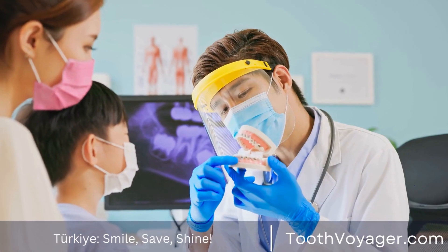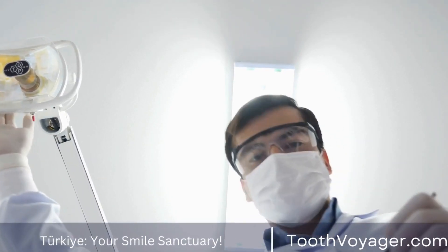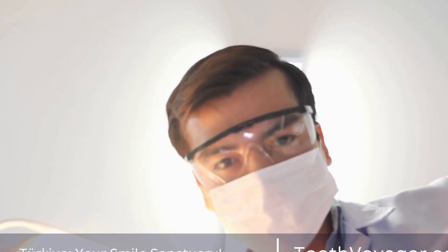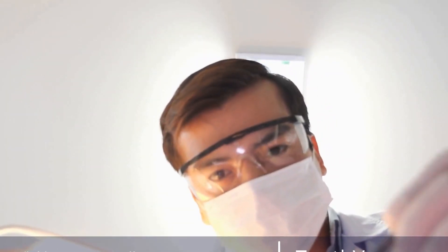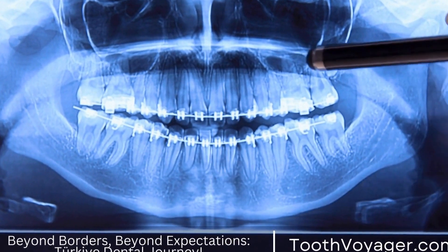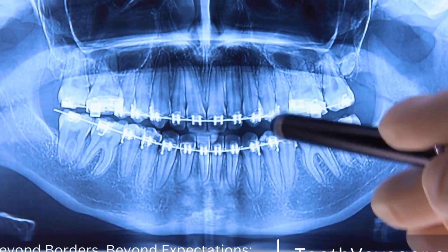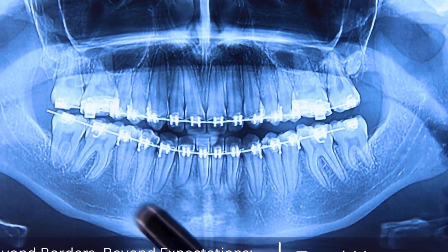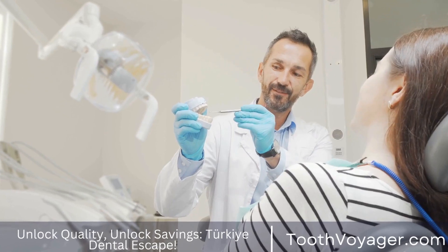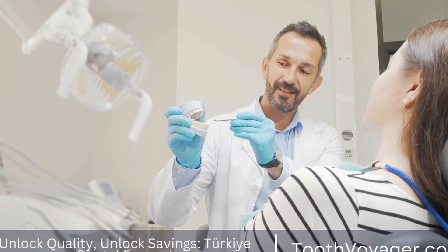Treatment Planning Software. Digital dentistry has also improved treatment planning for complex procedures such as dental implants and orthodontics. Specialized software allows dentists to analyze the patient's jawbone structure, tooth alignment, and bite mechanics to create a customized treatment plan. This helps to ensure the success of the procedure and reduce the risk of complications.